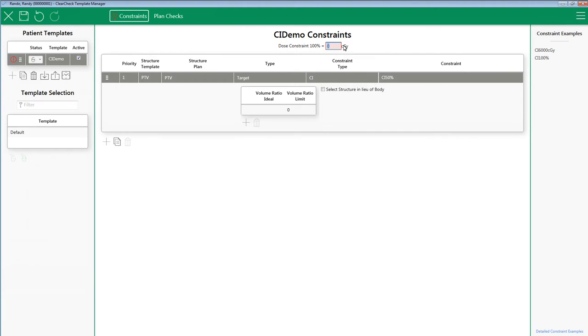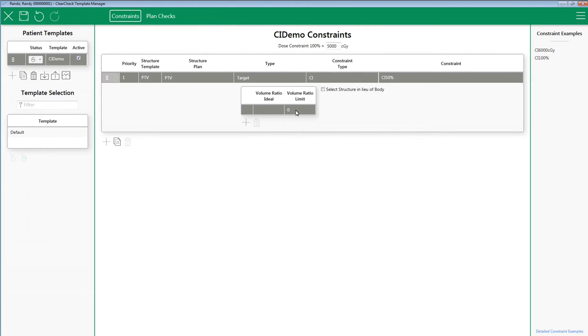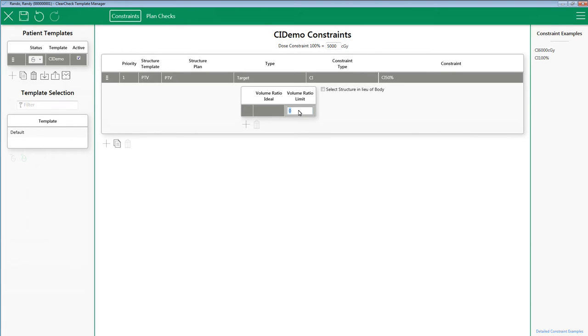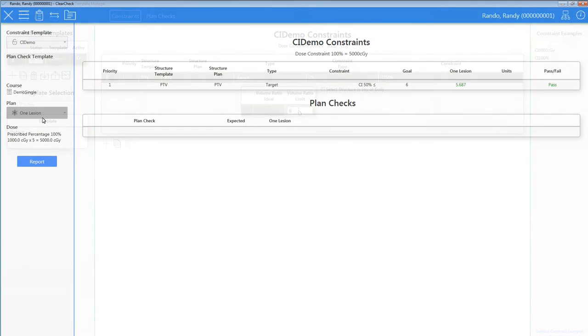If you want the most basic output for ClearCheck, you would simply put a volume ratio limit. For this example, I am going to say 6 for my ratio limit. It will either meet this goal and pass, or it will not meet this goal and it will fail.